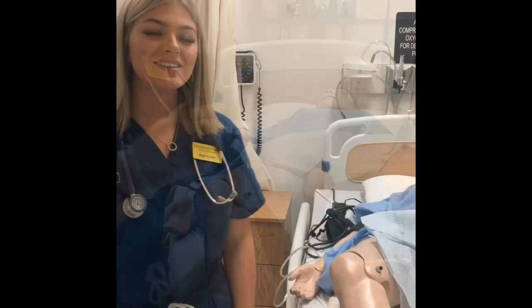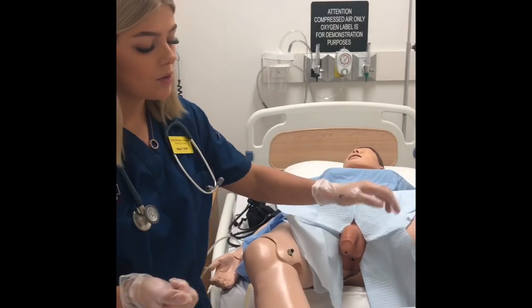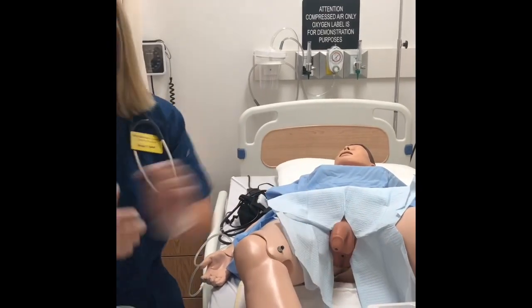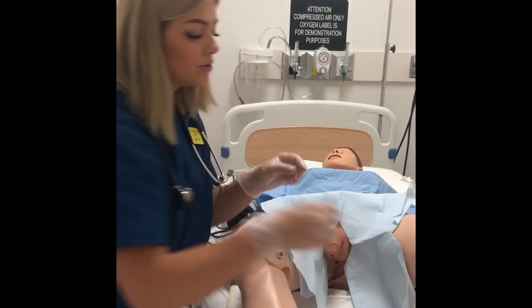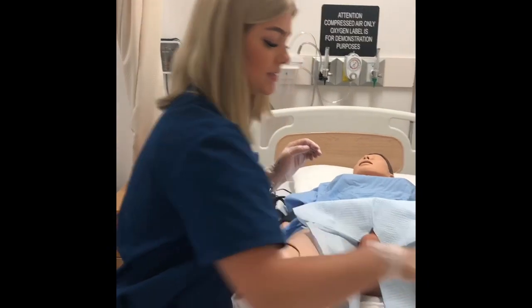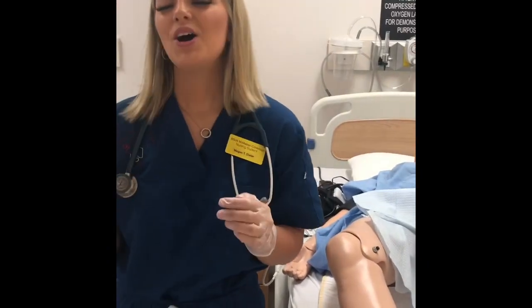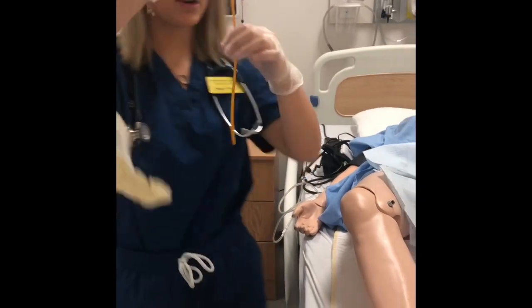And I have my lube. Okay, so I'm going to pretend that I have my iodine solution here. I'm going to rip it open and pour it in the container with the cotton balls, and discard that properly. I'm also going to grab my lube, open it up, and keep it in this basin. I'm also going to ask my classmate to open up the catheter kit for me so I maintain the sterile field. Perfect.